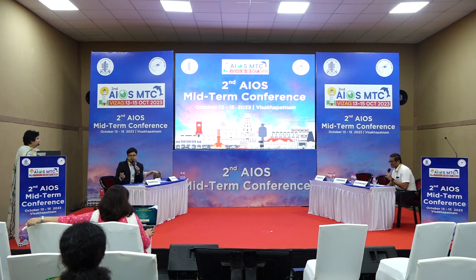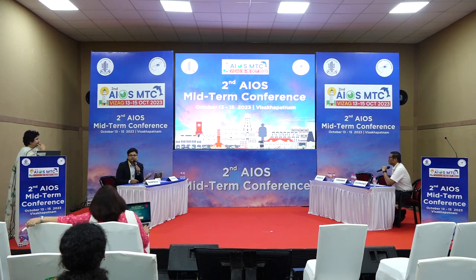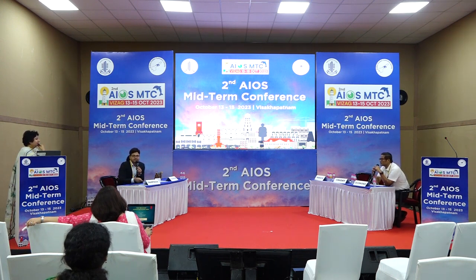Second, as you have seen in that video, please don't do it to and fro. It has to be unidirectional. Sorry, I have mentioned it in the last slide, in the points to remember, that for beginners you can try in the upward direction. I added that also. But it is actually the wrong way to do it in both directions. Only in one direction, it's always unidirectional. And for students, if the examiner asks you, the standard answer should be that it should be repeated, unidirectional, from the edge as well as the base. That is the ideal description of how to do scraping. Thank you.